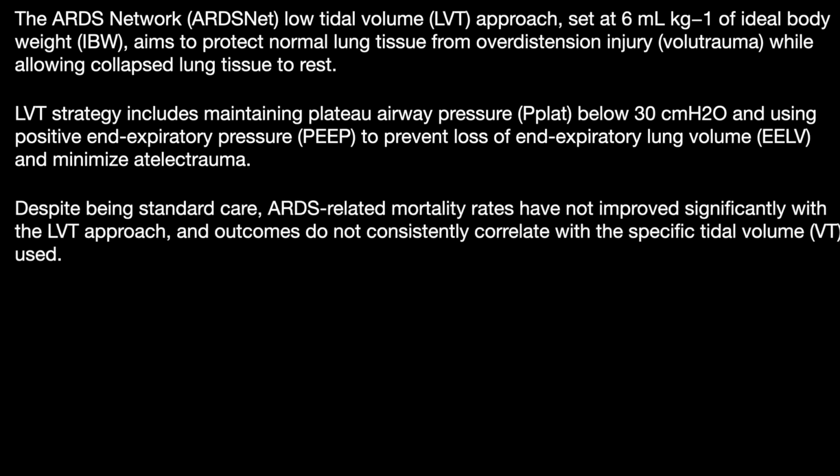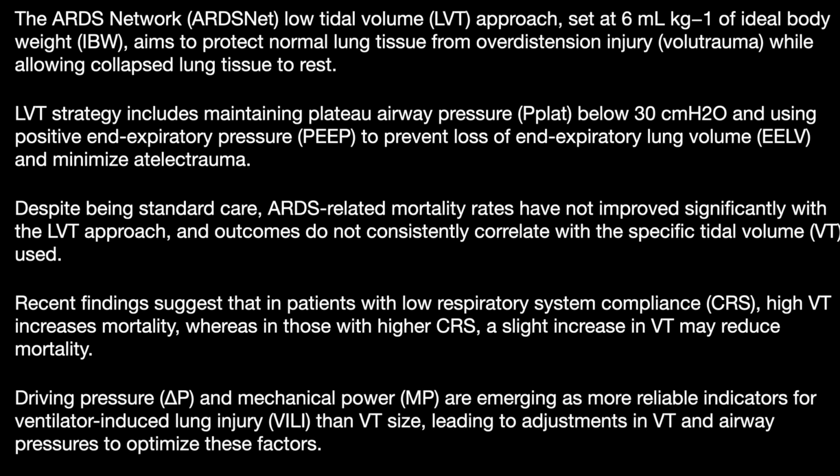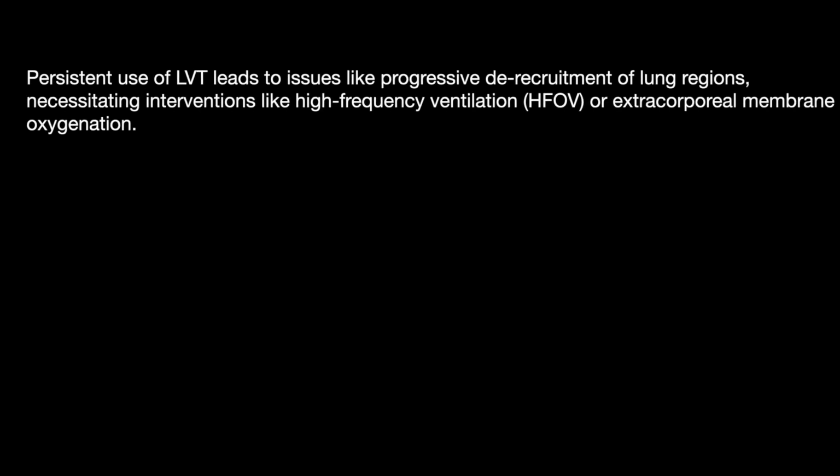Despite being standard care, ARDS-related mortality has not improved significantly with these approaches. Recent findings suggest that in patients with low respiratory system compliance, high tidal volume increases mortality, whereas in those who have a higher compliance, a slightly increased tidal volume may actually reduce mortality. Driving pressure and mechanical power are emerging as more reliable indicators for VILI than the size of tidal volume per se, and adjustments in tidal volume and airway pressure are made to optimize these factors, that is, the driving pressure and the mechanical power.